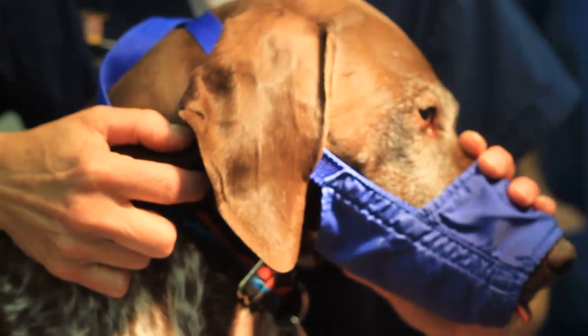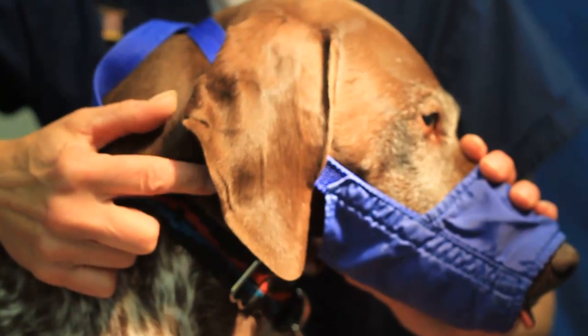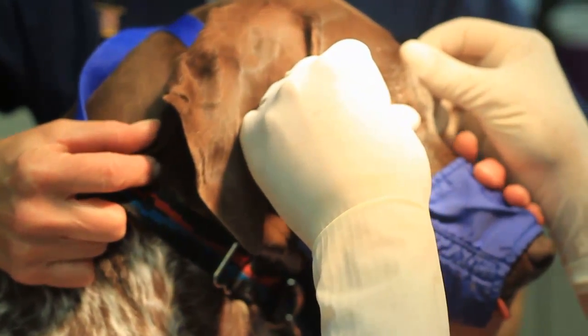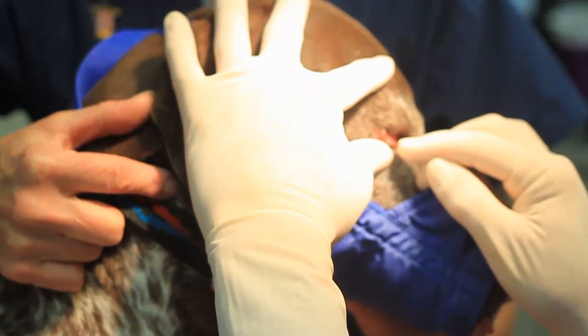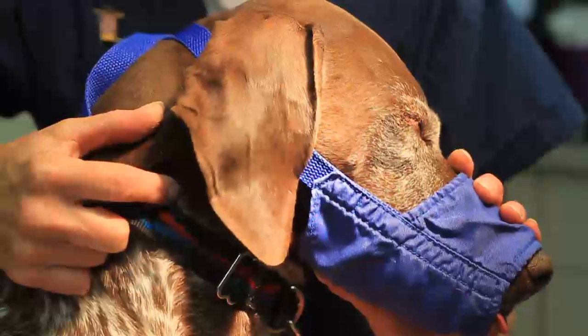One of the more common problems we see in dogs as they get older are tumors called meibomian gland adenomas. This is a tumor of the meibomian gland and what it does is it creates a stye — a very painful situation on the eyelid. The back of this we can see where a stye is starting to form. I'm going to show you an easy way to get rid of these things.